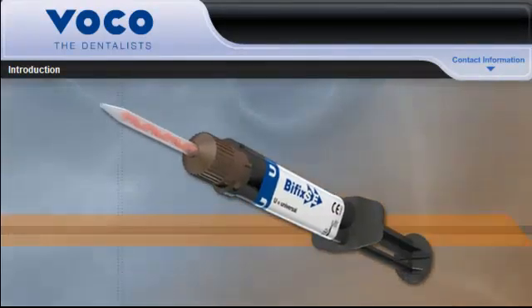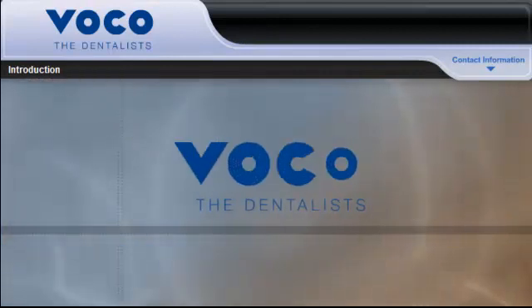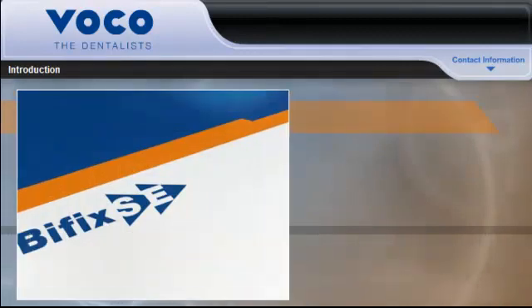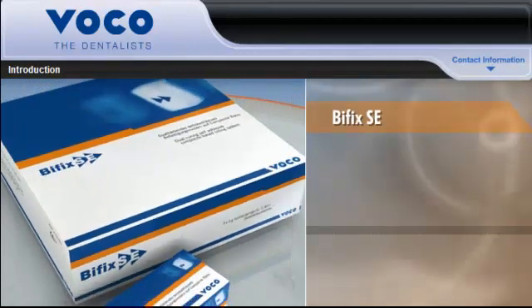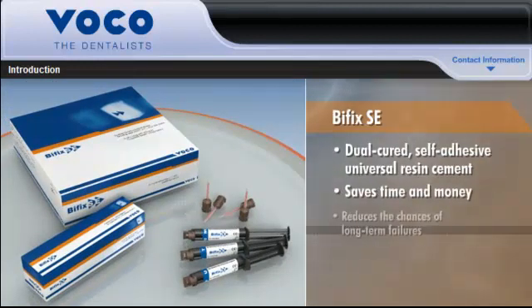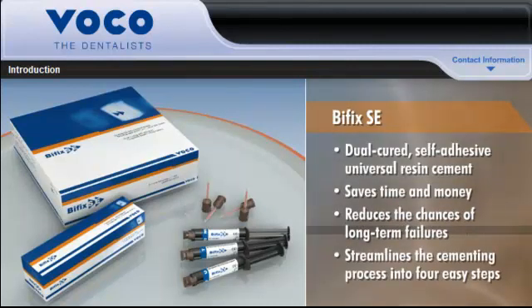Now there's a resin cement that has all the features you want. Voco, a global leader in innovative dental restoratives, introduces new Bifix SE, a dual-cured, self-adhesive universal resin cement that saves time and money by reducing the chances of long-term failures and streamlining the cementing process into four easy steps.